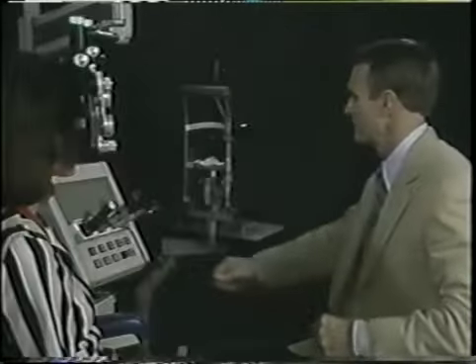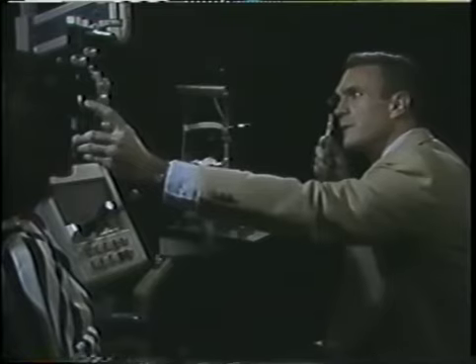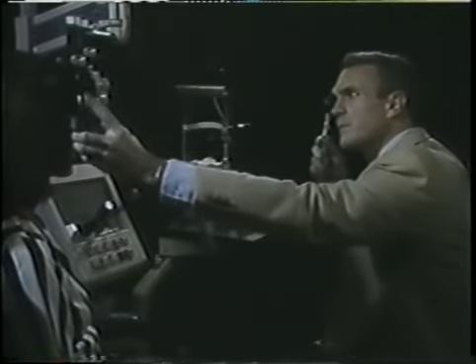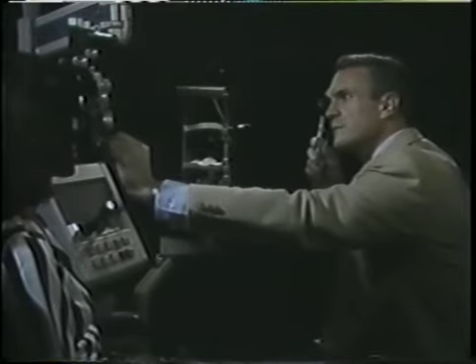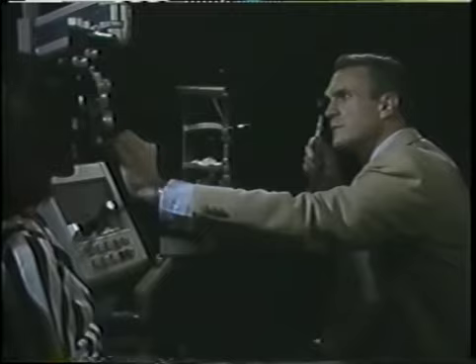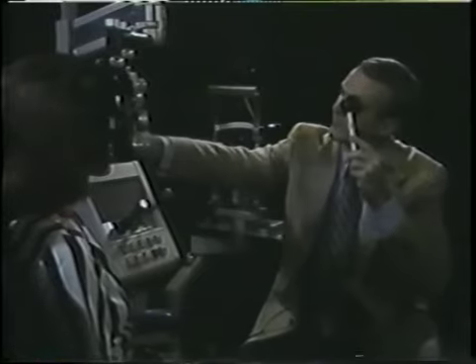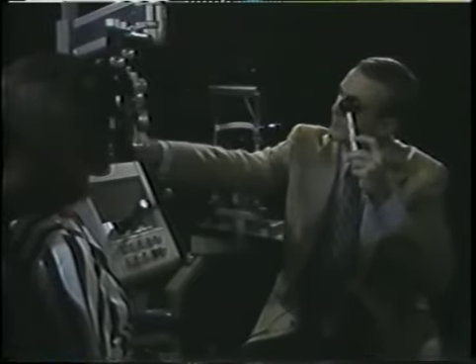Learn to retinoscope the patient's right eye with your right eye, and the patient's left eye with your left eye. This allows the patient to look past your ear with the eye not being retinoscoped at a small fixation light at the end of the room. You need to be as close to the patient's visual axis as possible for the best accuracy. And if the patient does not have strabismus, using the other eye for fixation is the best way to achieve the proper alignment.